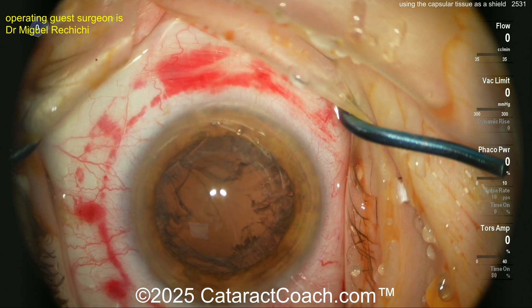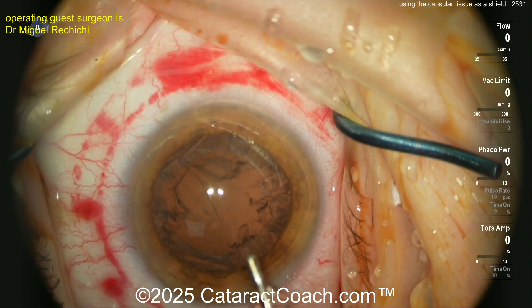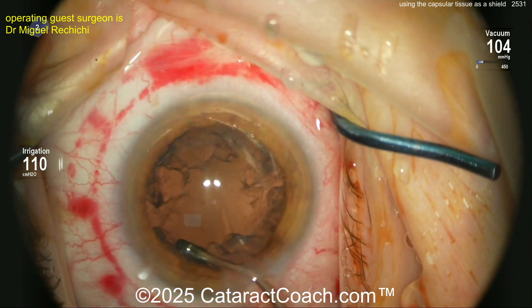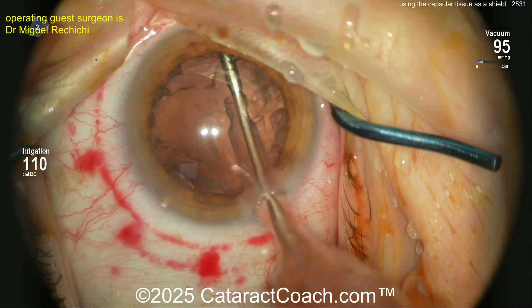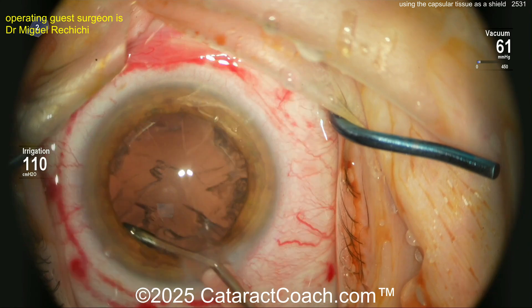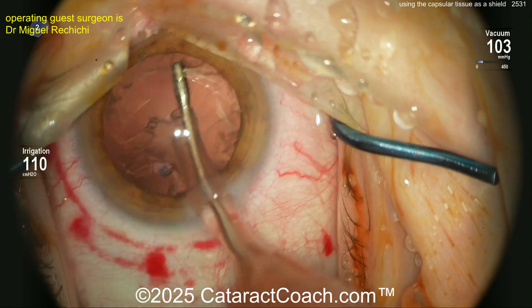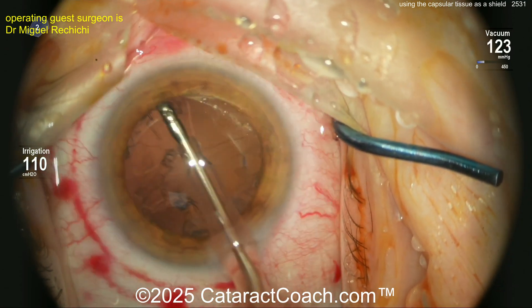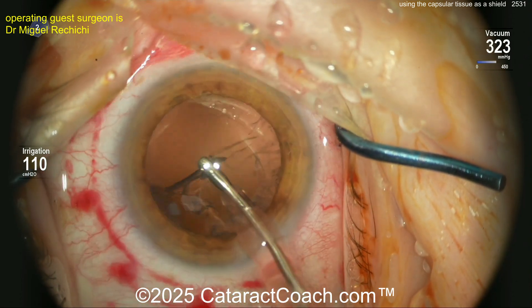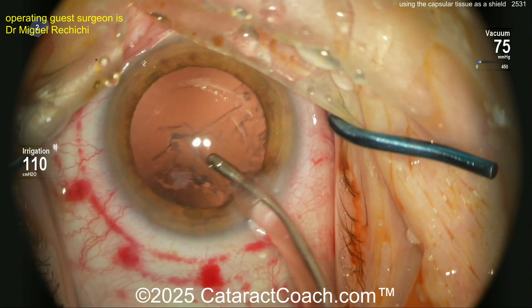CataractCoach.com — the world's most complete library of everything to do with cataract and anterior segment surgery, including cataract, glaucoma, cornea, refractive, and anything anterior segment. Now cleaning up the cortex at the end of the case. Looking at the remaining opening — more accurately called a capsulotomy, not a rhexis. Rhexis means you tore it, but here a laser was used, so it's a capsulotomy. Cortex comes out pretty easily, though in some femtosecond cases the cut anterior cortex can make removal a bit tougher.